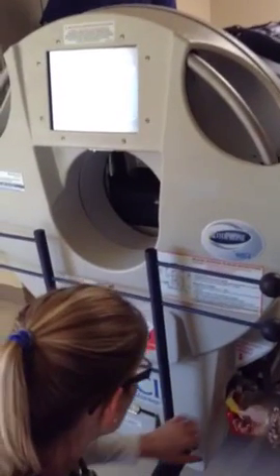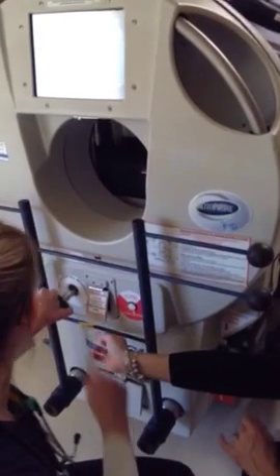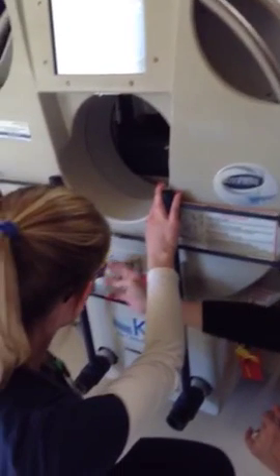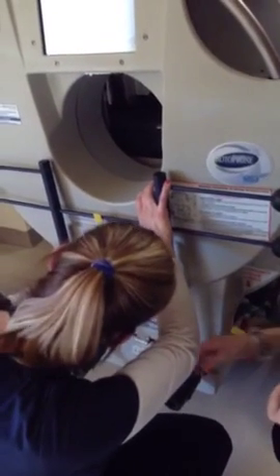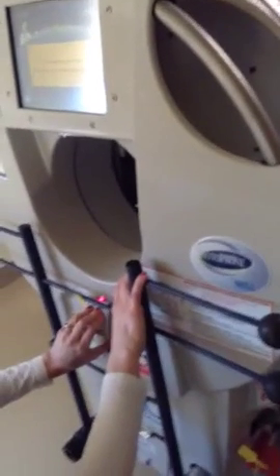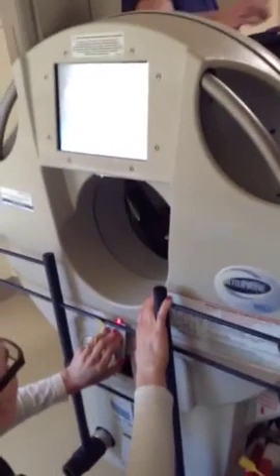So you're going to pull this, release this, pull the lock pin. This is going to be tie wrap shut. You're going to break this door open. Okay. Lift this, and I'll let y'all do it too. Lift this up, okay? And so prone patient. Do I hold it? Yes, hold it up the whole time.